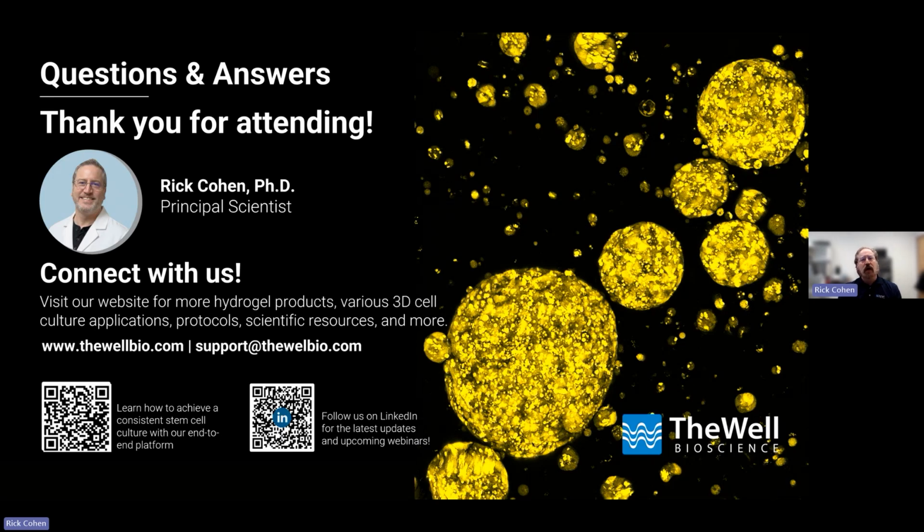If you go on the higher end, what will happen is you'll get aggregation of cells. So that's not horrible, but it could lead to inconsistencies. And I think everyone could see this picture, and that's our red fluorescent protein. You can see this little small sphere and a much bigger sphere.